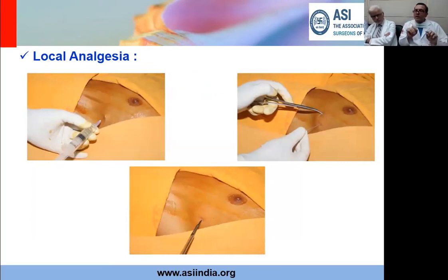You raise a skin wheel properly, but before you do that, please warn the patient that I'm going to put an injection. You will have pain, but after this, you will have a painless procedure. Allay the anxiety and then go slowly deeper into the muscles, and you will reach up to the pleura. It's important that you deposit some local anesthesia in the pre-pleural space also, because pleura is the most sensitive space.